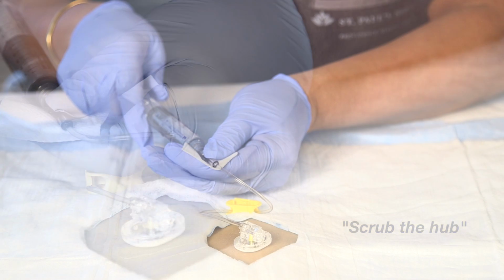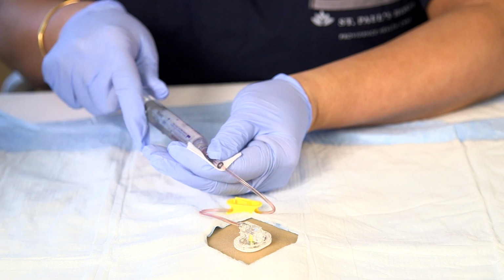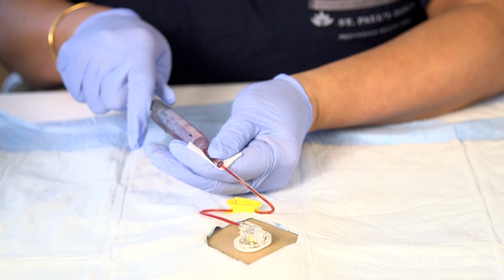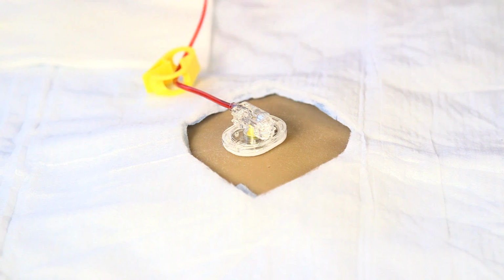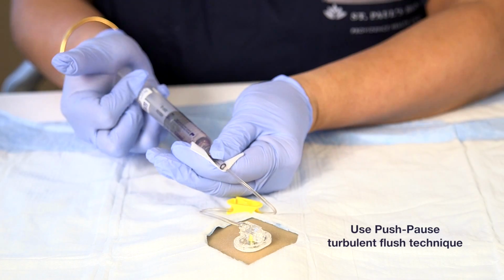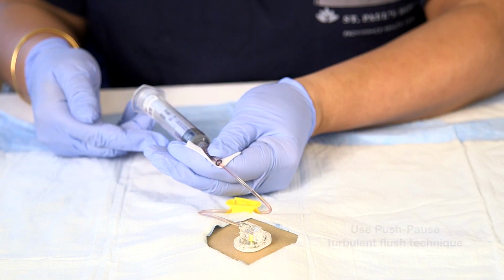Attempt to aspirate. If you cannot do that, you're going to flush 1 to 2 mils and then proceed to gently aspirate, pulling on the syringe plunger. Once you see blood come back easily, you're going to flush the lumen using a push-pause turbulent flush technique.